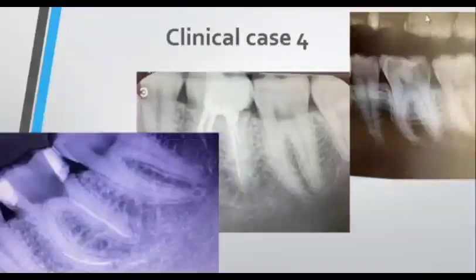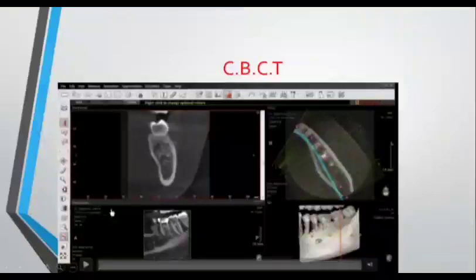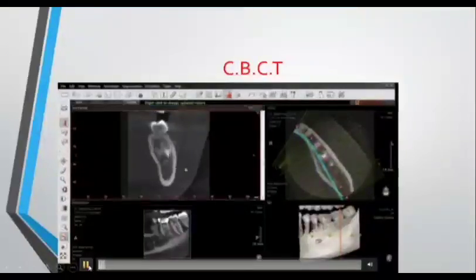As a humble endodontist, I don't have a microscope yet, so my first choice when dealing with broken files is to bypass. And it worked for me, as all broken files were bypassed. Let us show the CBCT for this case.